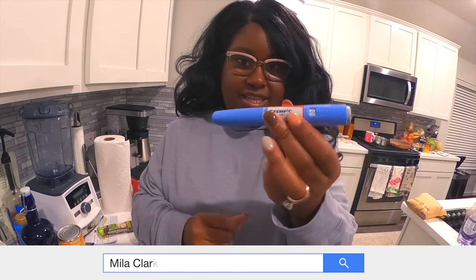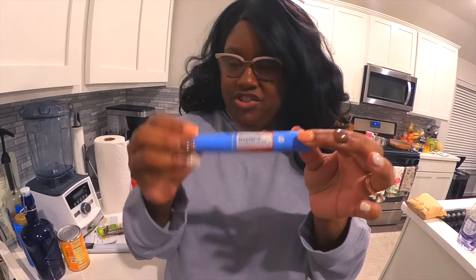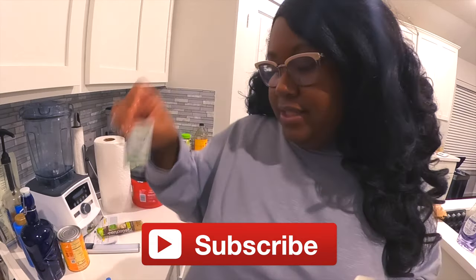I'm taking my second Ozempic injection. Ozempic is not insulin — it's a once-weekly injectable that basically helps your pancreas become more efficient. I've got some needles here and some alcohol prep pads, and I'm going to show you how I take my Ozempic.